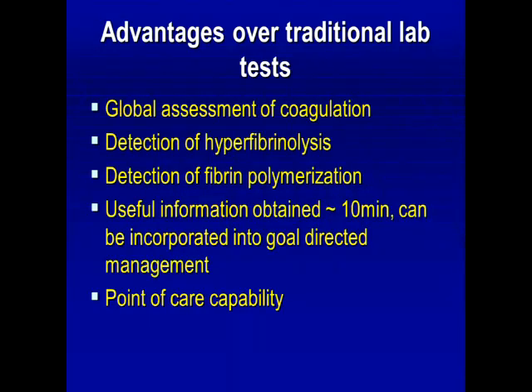The other big advantage is that you can detect hyperfibrinolysis. There wasn't really a good test that could quantitate this previously. The closest thing was probably a D-dimer, but that was fraught with unreliability, impossible to interpret in a patient who was critically ill, and it took quite a bit of time to come back. So not fast enough for trauma or any exsanguinating patient. It gives you information about quantity of fibrinogen and quality.